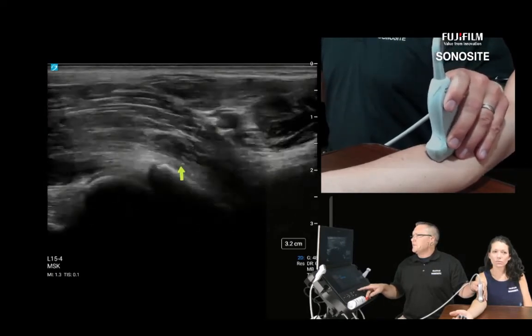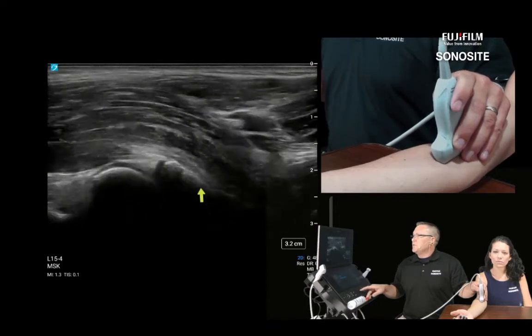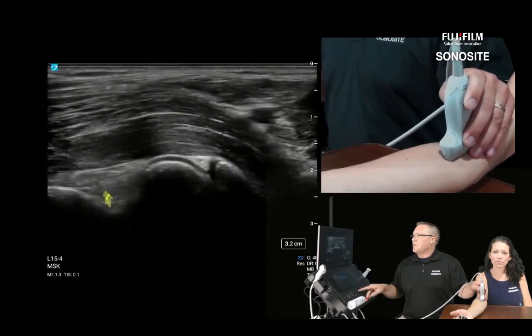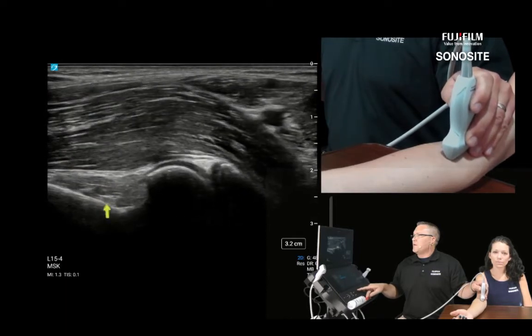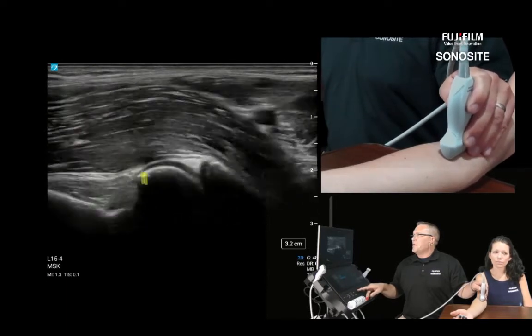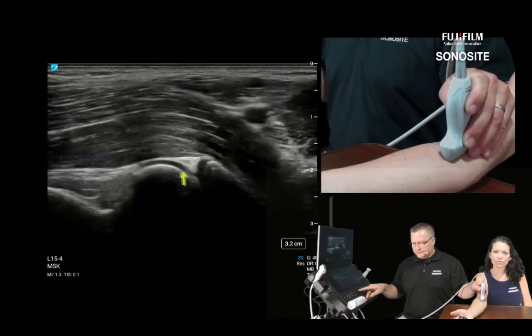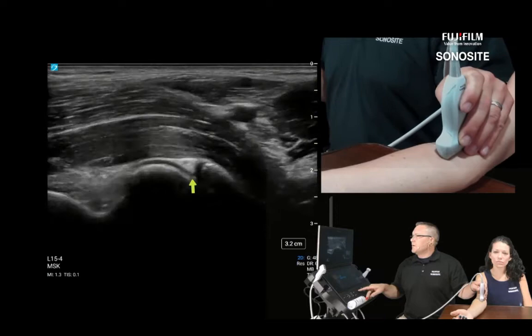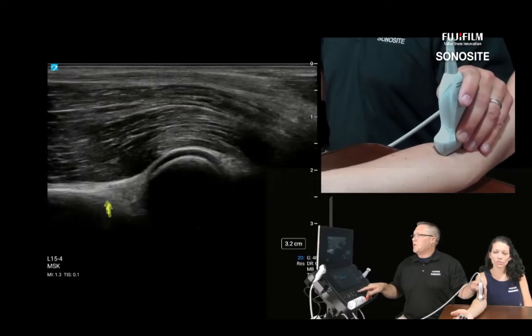Distal to that, I'm looking right here in the coronoid region for more effusion to dump out, and then proximally I'm looking in the coronoid fossa here, and I don't see any effusion to worry about here. Here's that nice fat pad that we're looking at here. So if I don't see a joint effusion, I'm also evaluating that cartilage surface again and wanting to pan across the joint for any underlying joint effusion that might be spilling out proximally where they tend to rest.